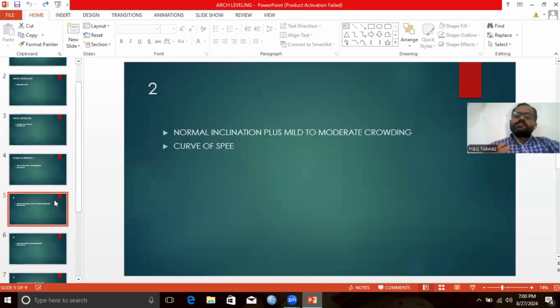We place a lingual arch because of some of the adverse effect of the intrusion of incisors, there's an extrusive force on the posterior. In adult patients, as we do not want extrusion of the posterior, placing a lingual arch will reinforce our anchorage.